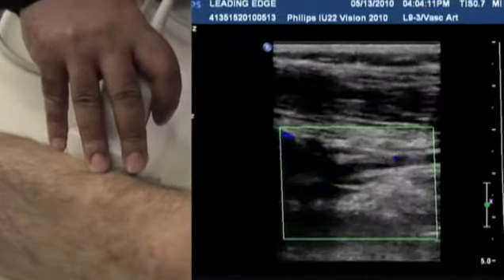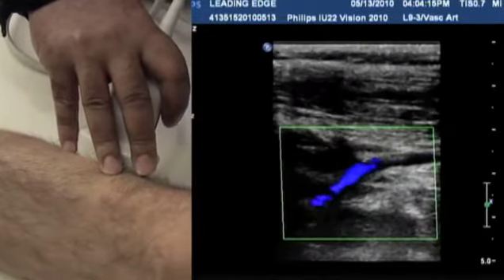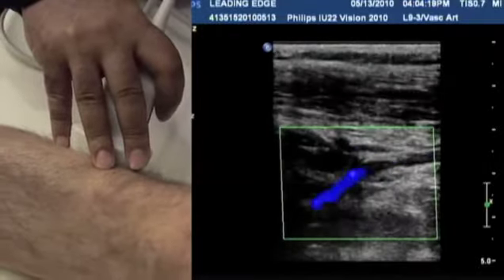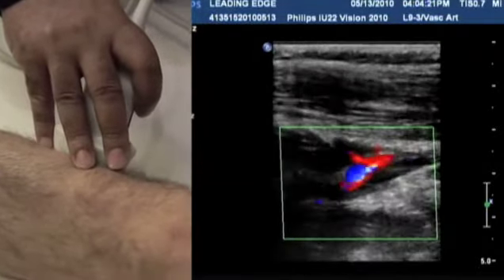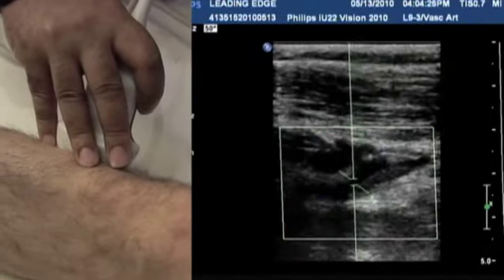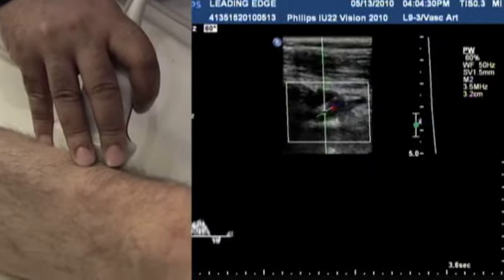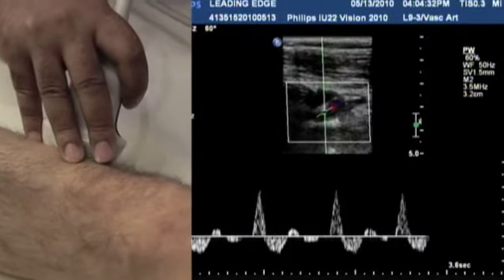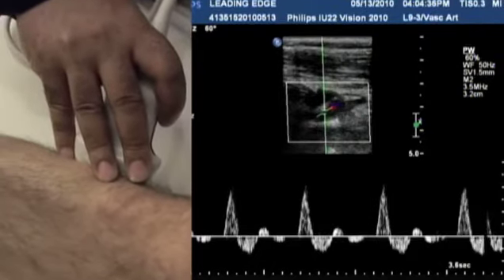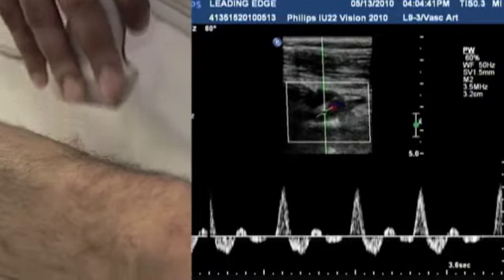And as you can see, this is the anterior tibial artery on the other side. And then let's take a quick look at that with Doppler. And invert, and you can see again no changes in the waveform there, and that would tell me that probably there's nothing going on in that short area that we're just not able to visualize because of anatomy.